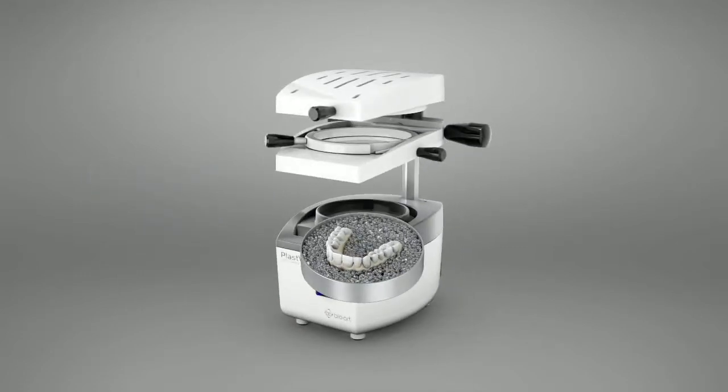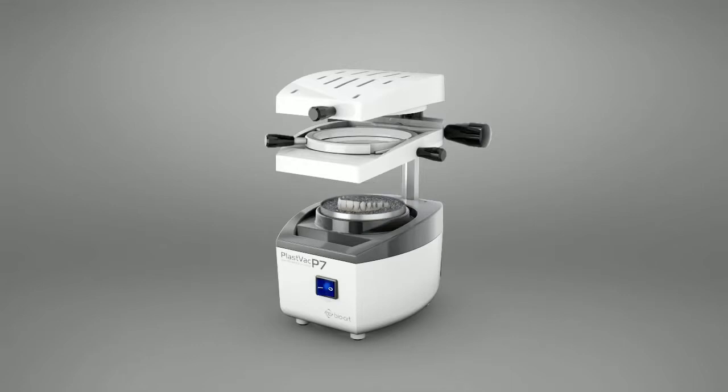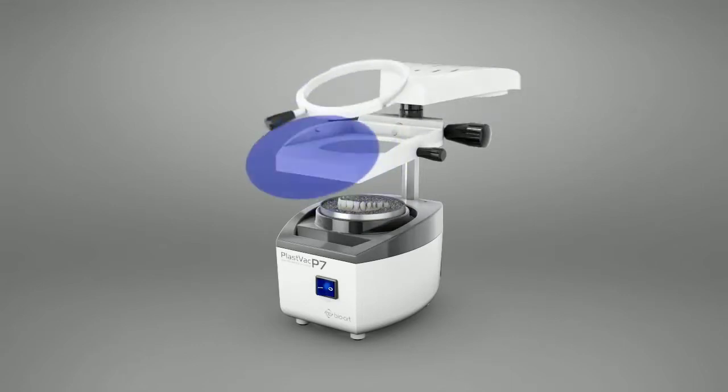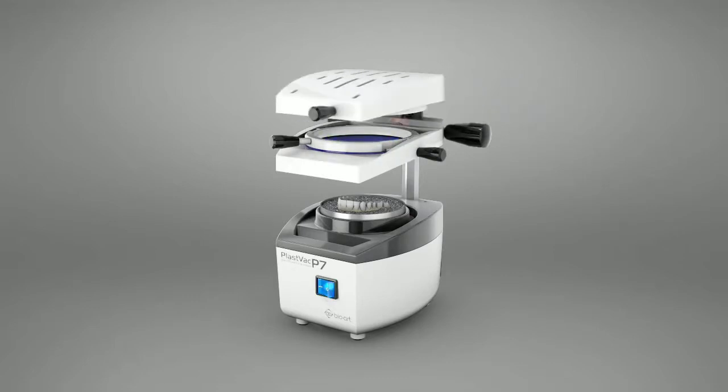The vacuum forming system is a process where a sheet, which can be of different materials, is heated and conformed on a plaster model by vacuum to give the sheet the desired shape.